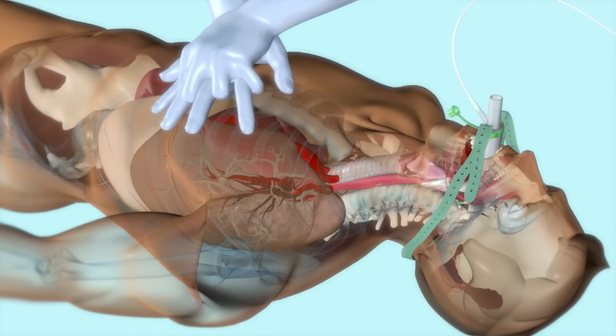The difference between the standard IGEL and the IGEL-02 is that the IGEL-02 device has a supplementary oxygen port for the delivery of passive oxygenation. Passive oxygenation is usually delivered as part of a cardio-cerebral resuscitation protocol. Of course, the IGEL-02 can still be used to deliver traditional standard ventilation through the main airway channel — this is simply providing an alternative option.